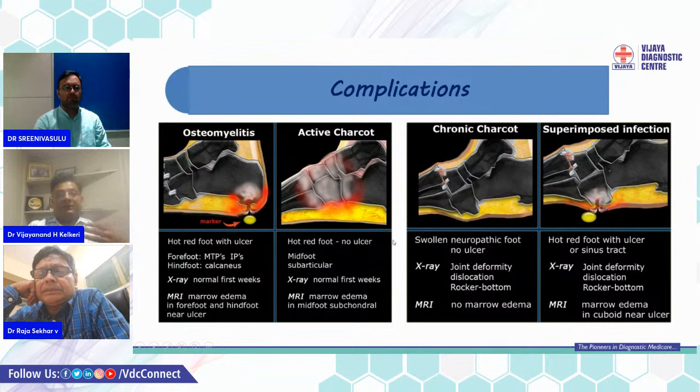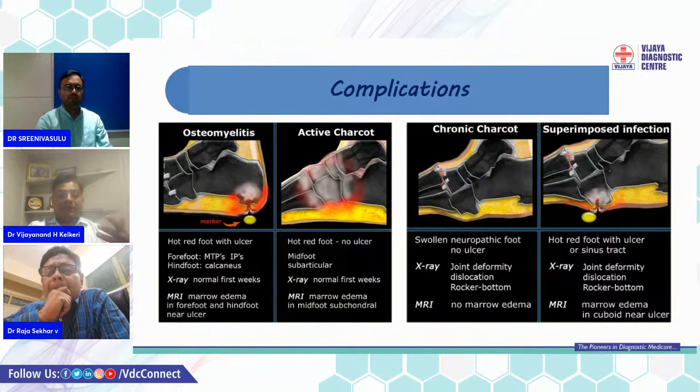So whenever there is a requisition from the clinicians that they are suspecting these things, we should look with eagle's eyes and try to look for the subtle findings, unless we do an MRI. Once we do MRI, it's basically clear.